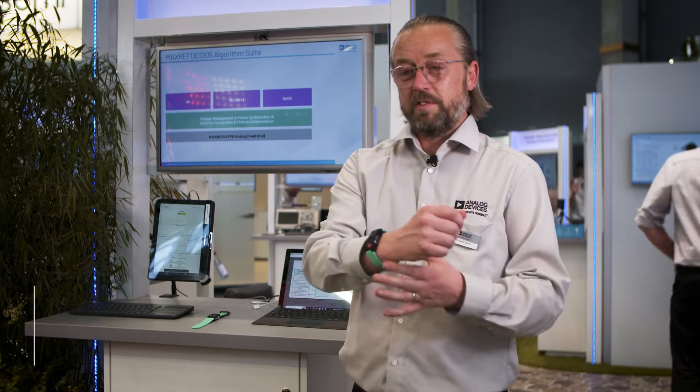Hi, my name is Richard Ward from Analog Devices and today I'm going to talk about the MAXREFDES105, which is a wrist-worn evaluation platform showing our latest algorithms and optical sensor, which is the Analog Frontend.